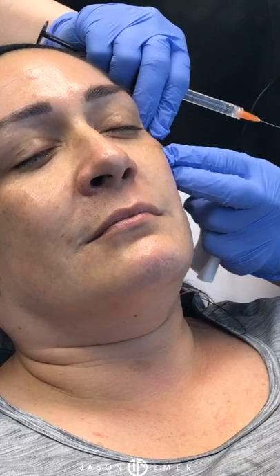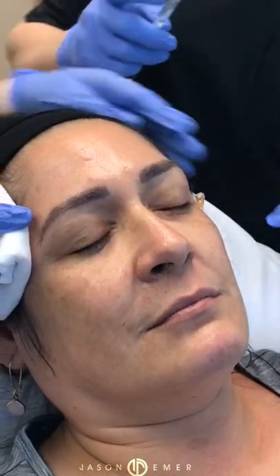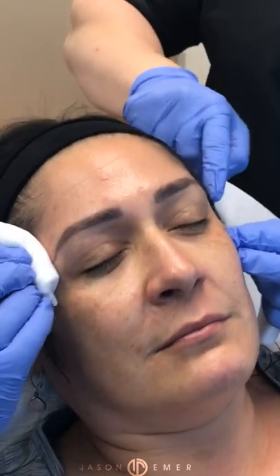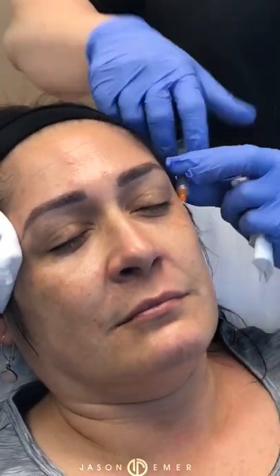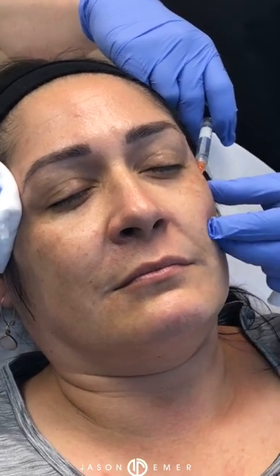The next part is, because she has a more structured face, I really want to give her definition on her cheek. So we're going to do 2 techniques. We're going to do lateral injection technique using a cannula just to help limit bruising and pain. It's just going to feel a little weird. And we're going all the way down onto the bone into the deep medial fat pad, which supports the cheek. And this is a nice area to inject the filler because everybody gets this little line right here where the cheek starts to fall down. And by giving support deep here, it will lift this up.